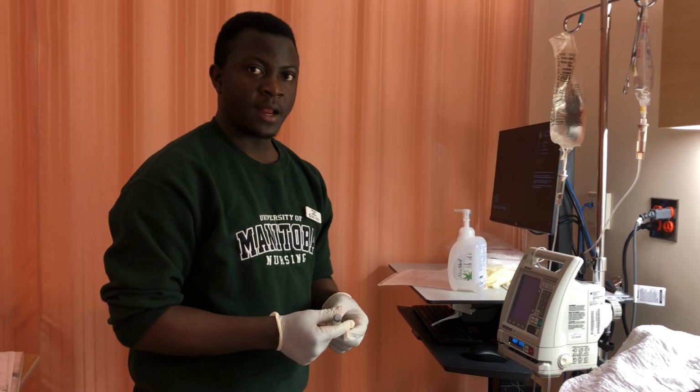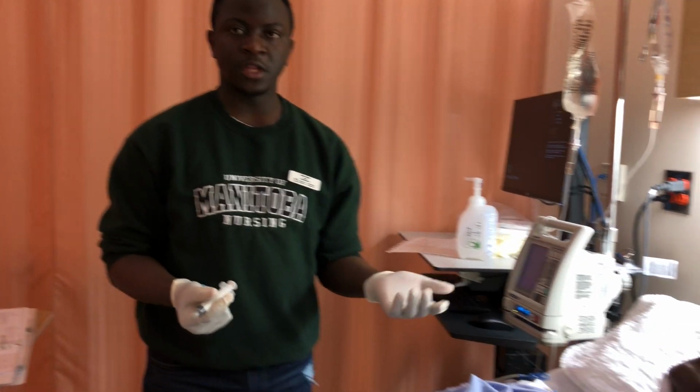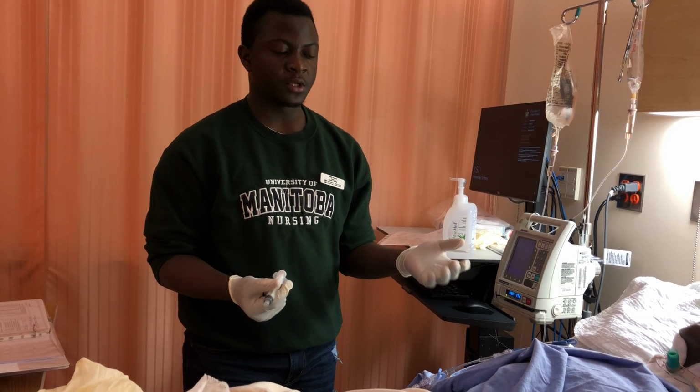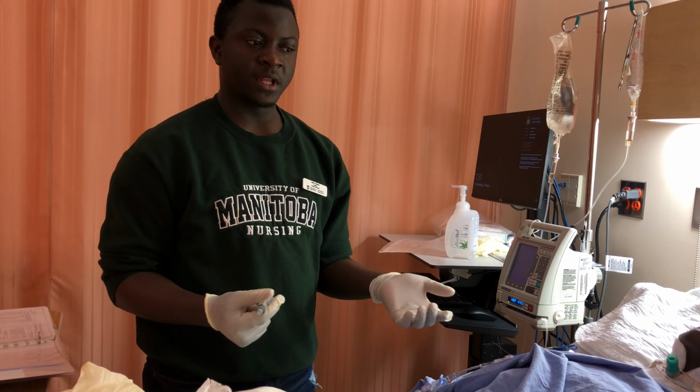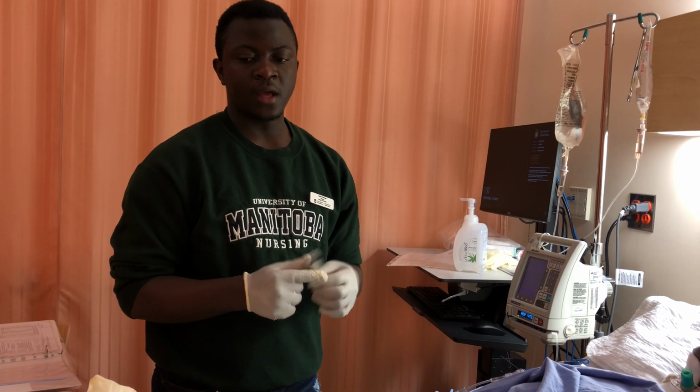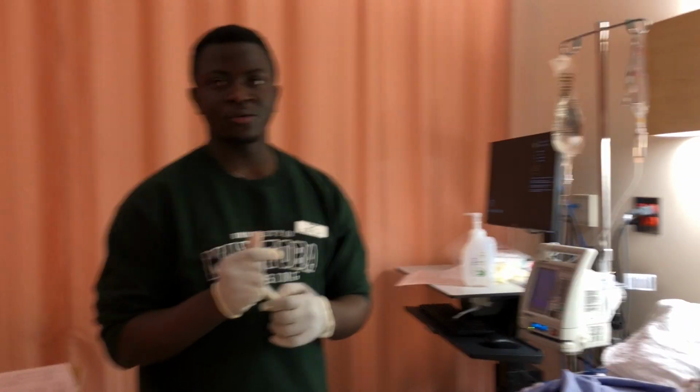It's dropping, and I will tell the patient to let me know if they feel any discomfort. I'll also let them know the signs and symptoms, if they have any bleeding or if they see any marks like petechiae or anything, and that's it. Thank you. I'm going to turn it off.